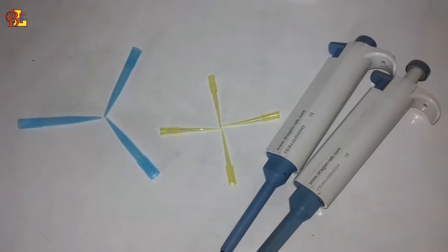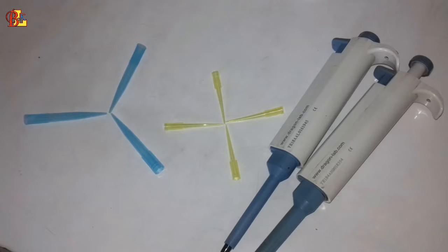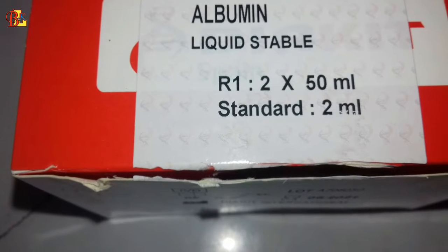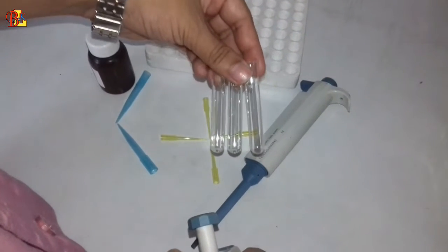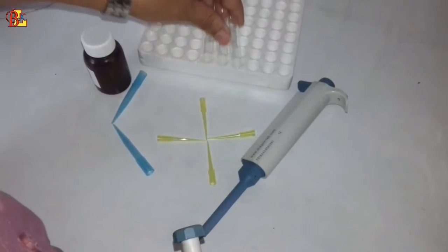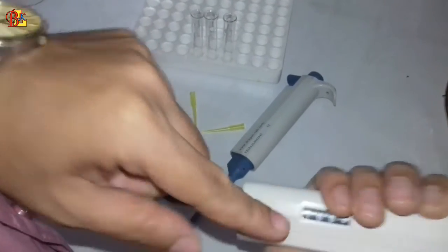We will test this albumin. The equipment currently on the screen is the albumin reagent, and we will do this test with this reagent. Looking at the test tube I have in my hand right now, in this test tube we will take reagent — specifically, we will take 1000 micro of reagent inside this test tube.